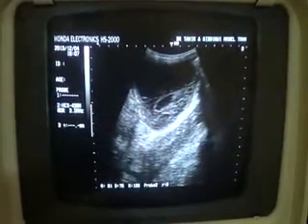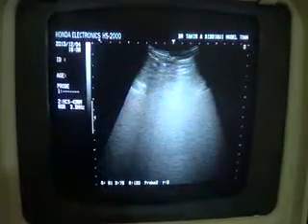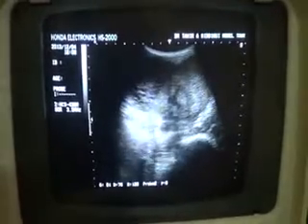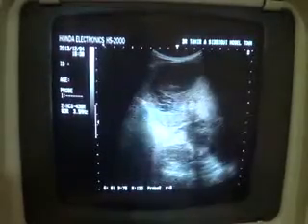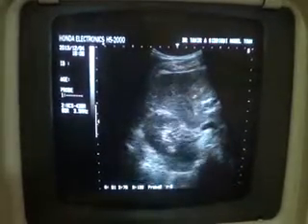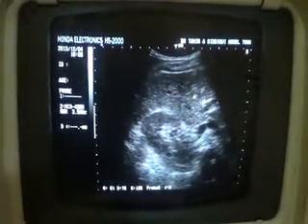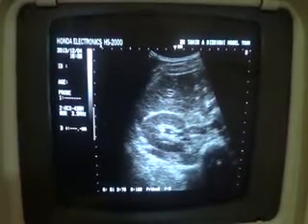Now this is the right hypochondrium. Below the costal margin is the region of the right hypochondrium, and in this region you can see a large mass. This is the liver. This is the right kidney. The kidney is normal. The liver shows minor portal radicle prominence, suggestive of decreased liver echogenicity.